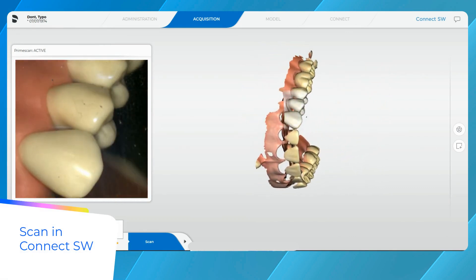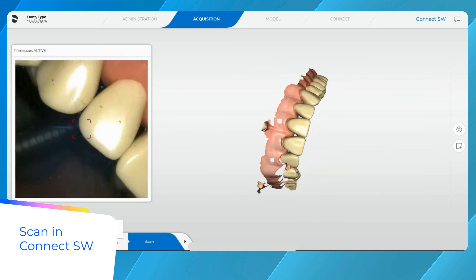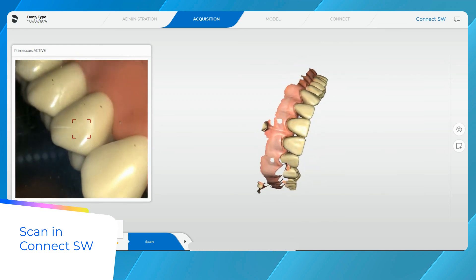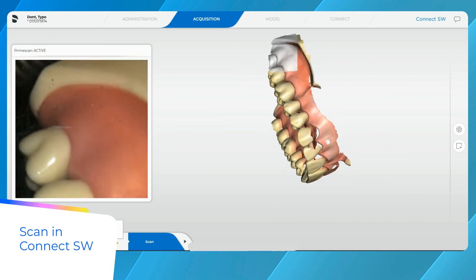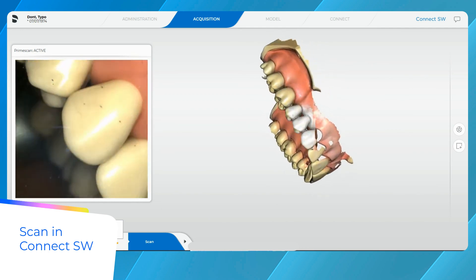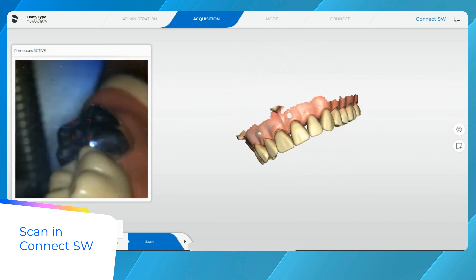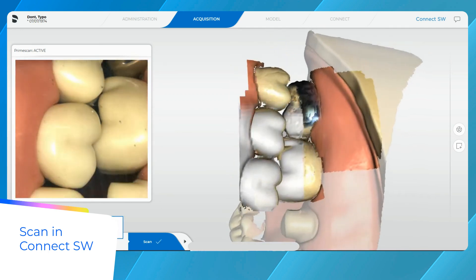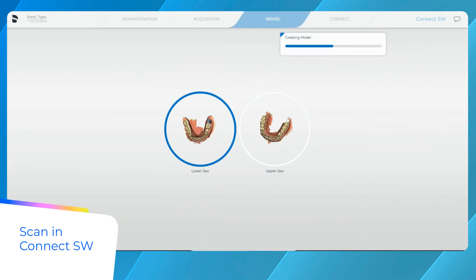You might notice that the administrative phase in Connect software is greyed out. Although the patient data is sent to Connect software and created in the patient list, and the digital impression you are taking is also saved in Connect software, the system won't allow you right now to make changes to the patient entry.